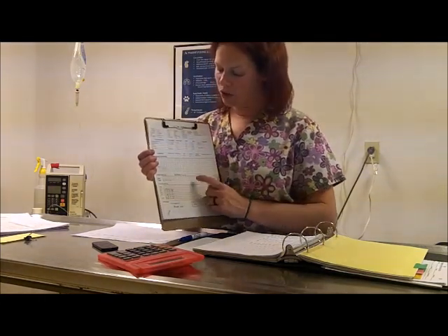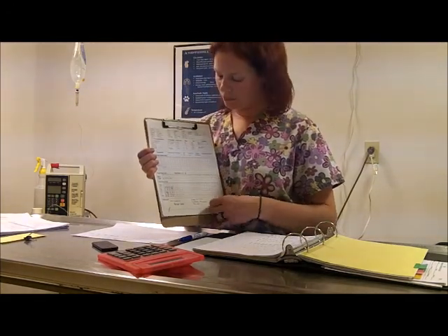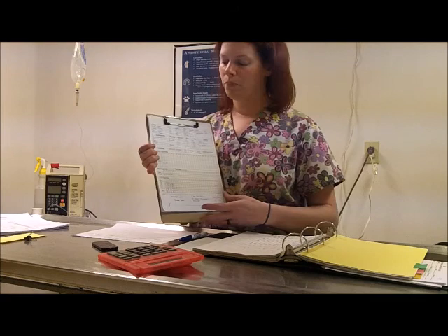The next section here is the anesthesia information, so marking the type of anesthesia that we are using, in this case isoflurane versus sevoflurane, the oxygen flow rate, the endotracheal tube size, the type of thermal support that we are providing for our patient, whether it is a warm circulating blanket or a hot air blanket, and then whether or not we're using a non-rebreather.